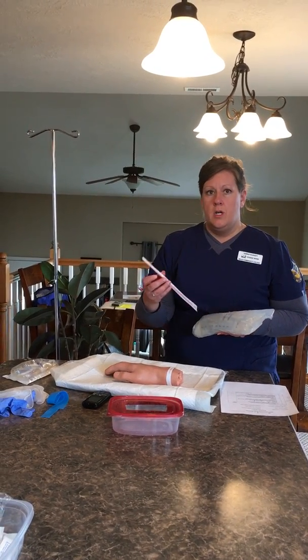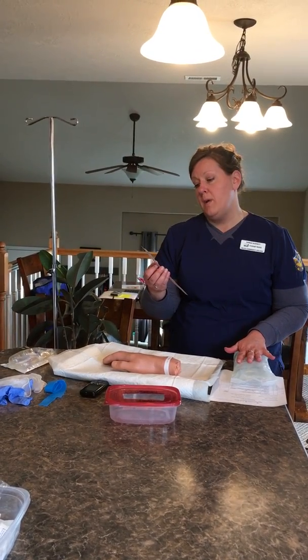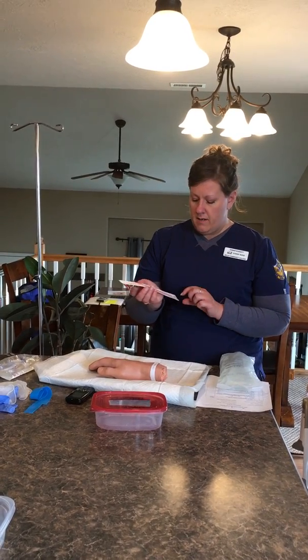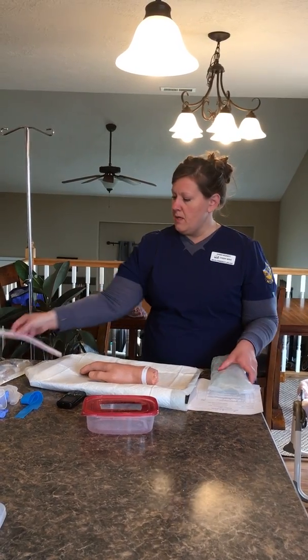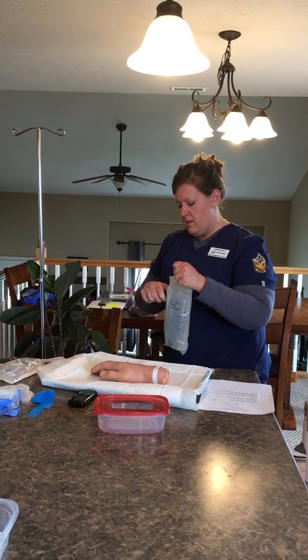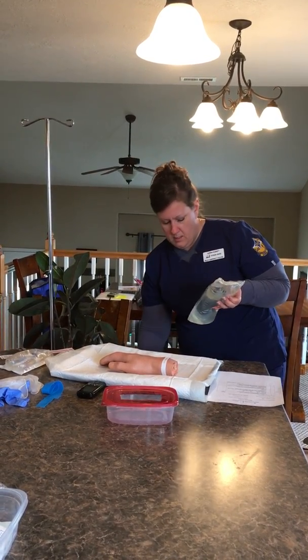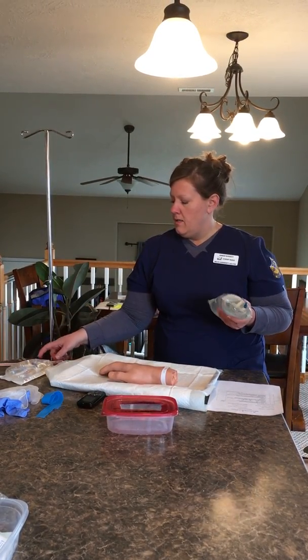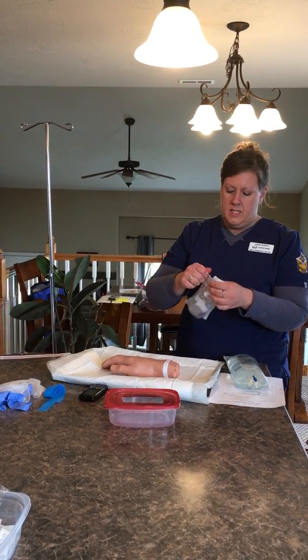As far as the dosage goes, I will put that it's 28 drops per minute over 6 hours. And at the top we have the starting time of 13:05 and the ending time of 19:05 per the MAR. Since everything looks good, I'm going to go ahead and open my solution, and I'm going to open up my flow set.